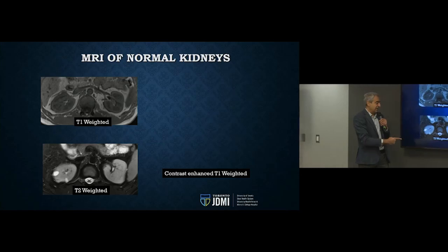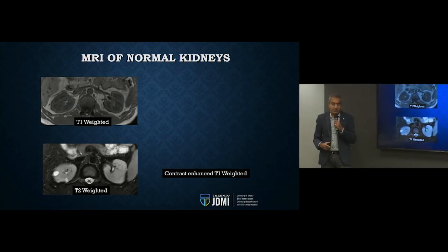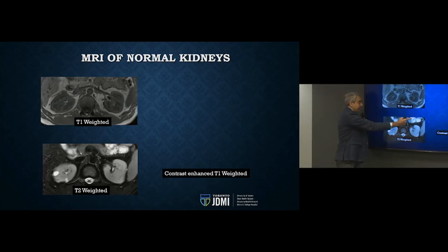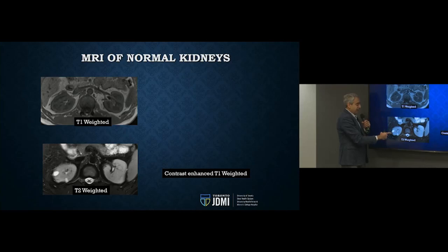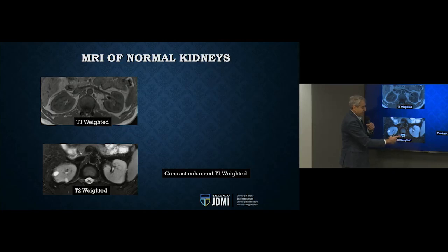And in this kind of image, the T2 weighted image, what we're trying to do is maximize the signal that we get from water. So really what we're looking at here is the relative presence of water in the different areas. And so we can see that, let's say in the spinal cord, there is the cerebrospinal fluid. So watery stuff will appear really bright.